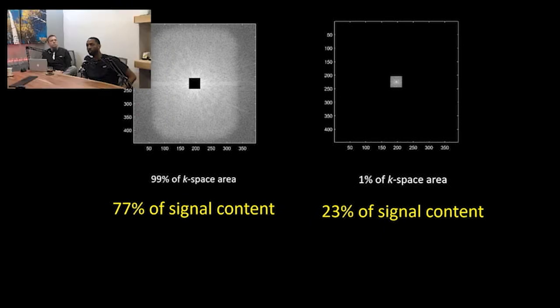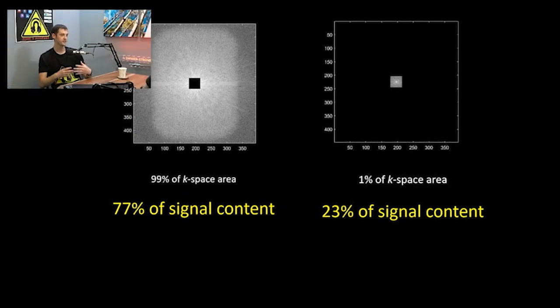Well, I know too, when you turn on k-space, you need a certain amount of signal or you get this horrible artifact, and most of your signal is right in the center. So if we're grabbing that automatically, why are we still getting that? Is that some kind of geometric issue? Well, you still need the edges because they define the lines and edges. The edge of k-space defines the edges in the image, and the center of k-space determines the image contrast and most of the SNR, the signal. All right, okay.